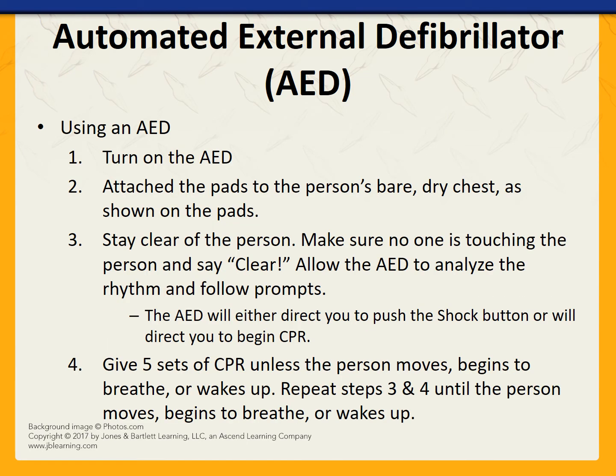How to use an AED. Using an AED is very simple and really helps you with your CPR process. The first thing you must do is turn on the AED. Next, attach the pads to the person's bare, dry chest as shown on the pads. Next, stay clear of the person. Make sure no one is touching the person and say "clear," allowing the AED to analyze the rhythm and follow the prompts the AED provides you.